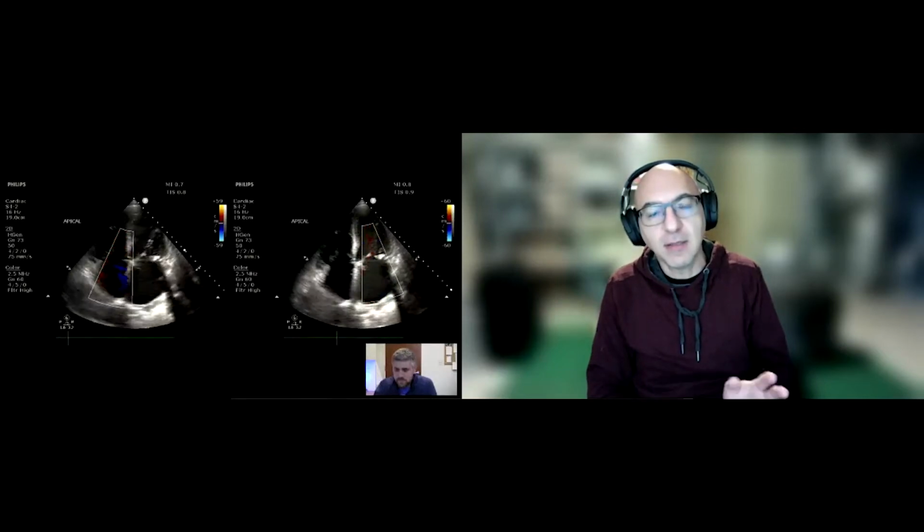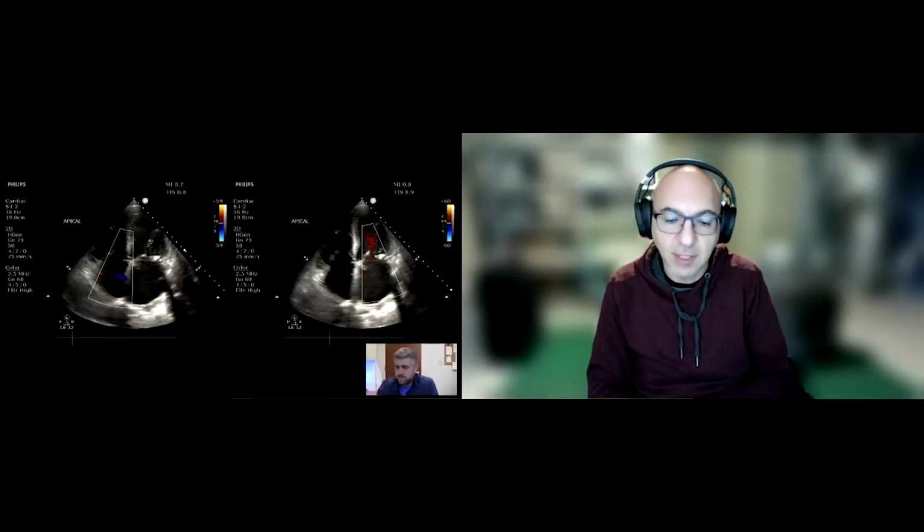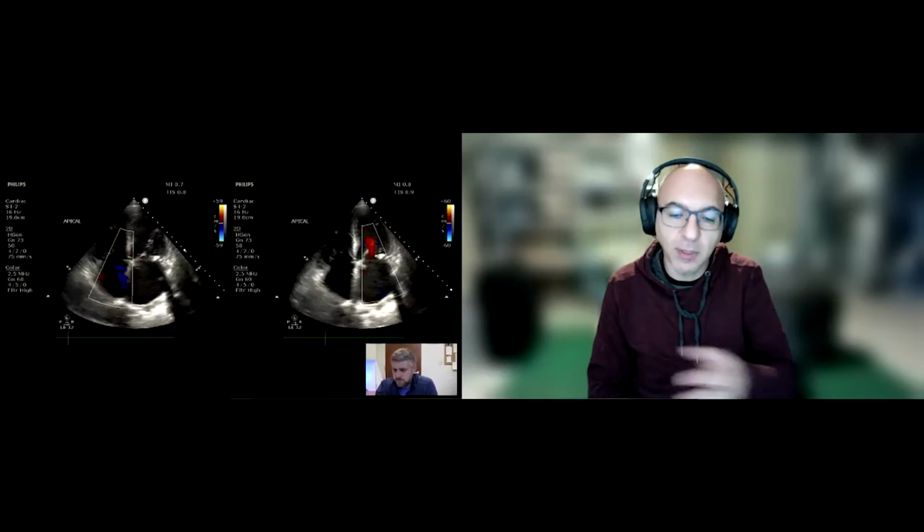That's for non-intubated patients. Or if the person is intubated and you can afford to put them on a spontaneous breathing trial without PEEP, then they can behave as if they're non-intubated. And the higher end is 2.1, and again 50% or 20%.